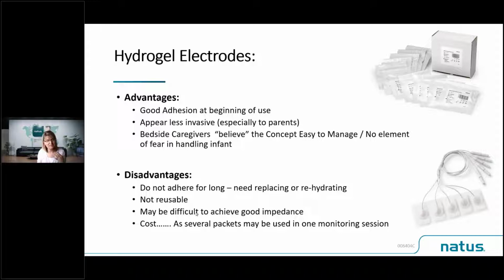And sometimes, dependent on how well you've prepared the skin and moved the hair, it may be difficult to achieve really good impedance levels with hydrogel electrodes. And also consider the cost. People think that they're more cost effective because per packet they don't seem so expensive. But remember, you potentially may need more than one pack per monitoring session because they may not last forever. So just consider that also.